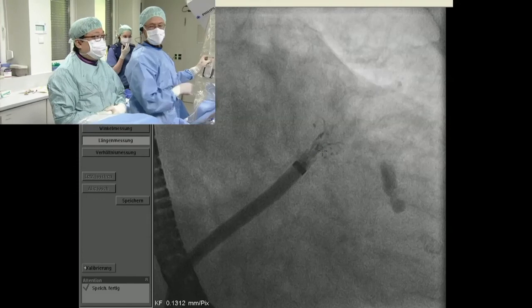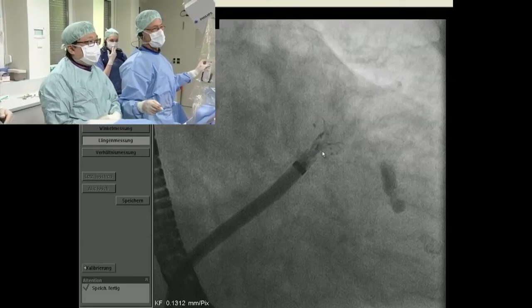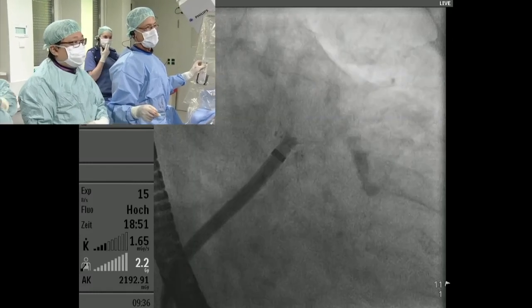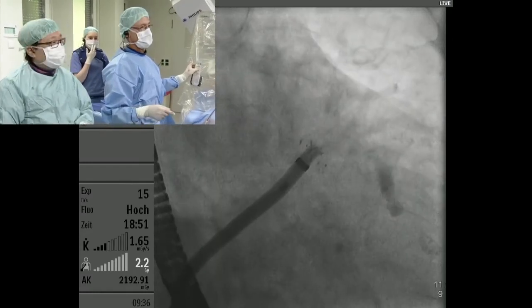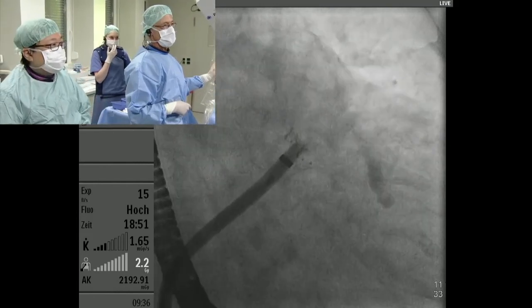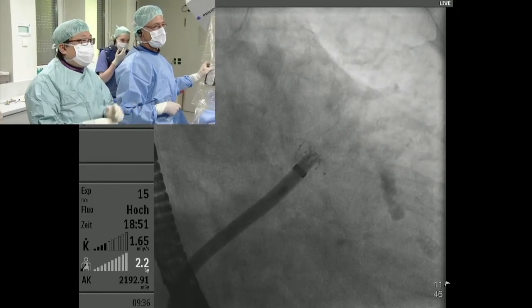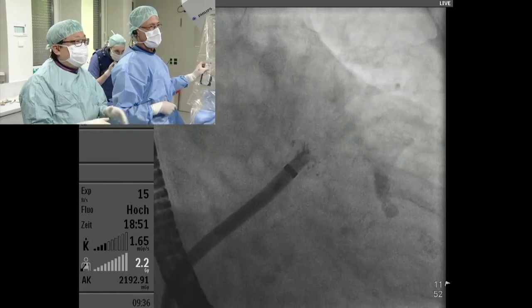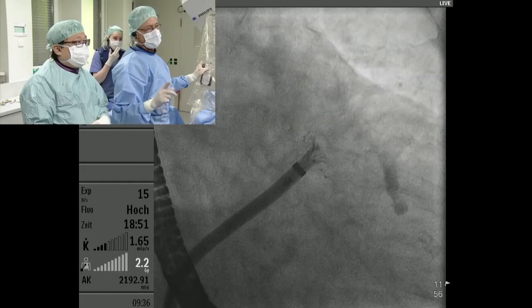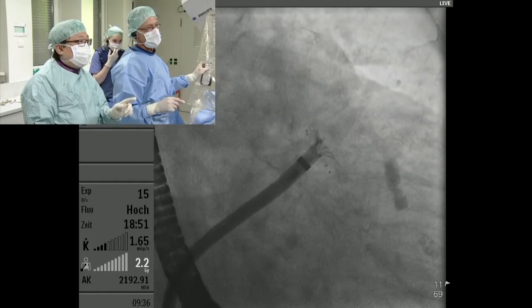Okay. And explain that again. Can you stop the measurement? Let me forward it first. You see these tiny dots are actually coming down. And now all of them are coming down. Yeah, but this is not the difference yet. The radio-opaque mark is not coming out yet.